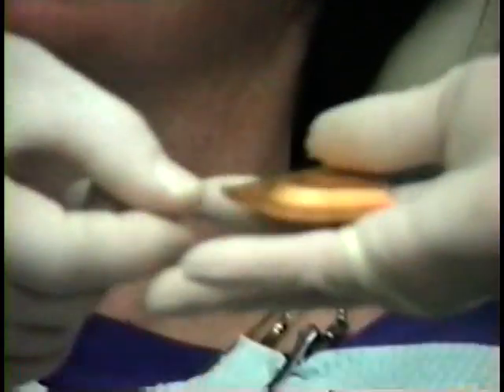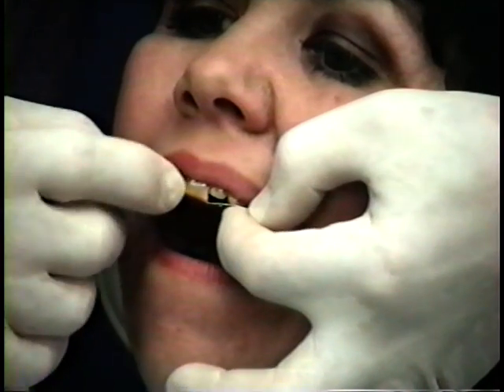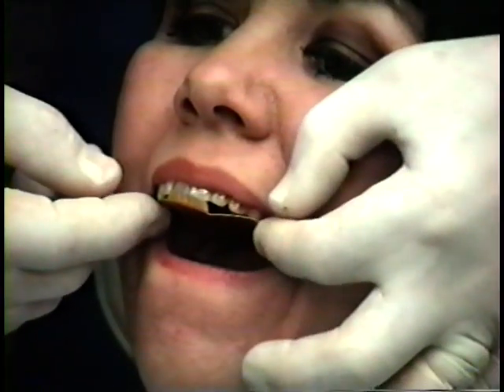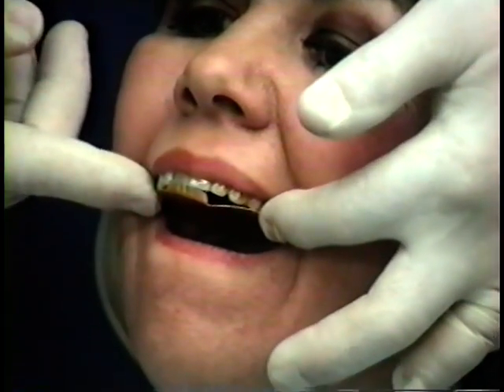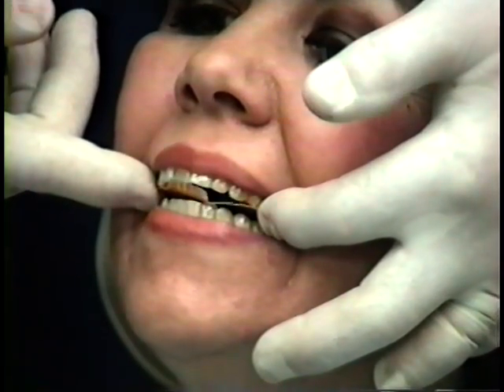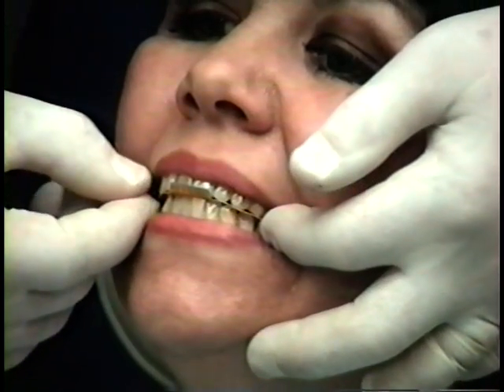We now take the second tray for our protrusive record. Place it between the teeth and align the midline of the flange of the tray with the midline of the patient's mouth. Move fingers to the bicuspid areas and have the patient bite together as hard as they can to crush the tray to conform to their teeth.